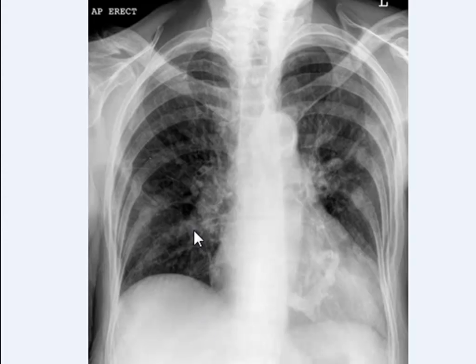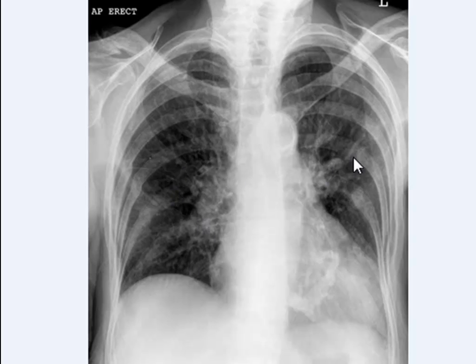This parenchyma is normal for age, but that's how you can differentiate between an old patient and a young patient. Thank you very much.